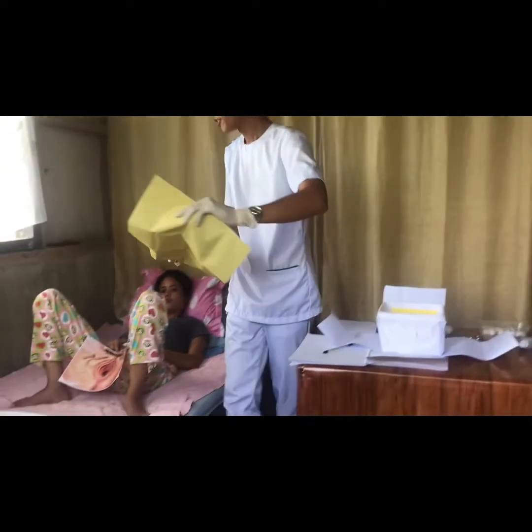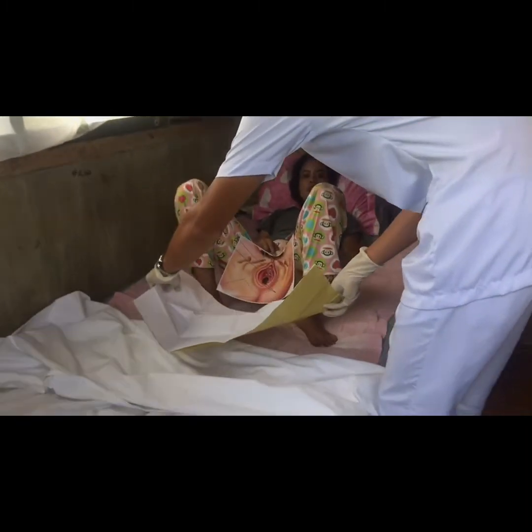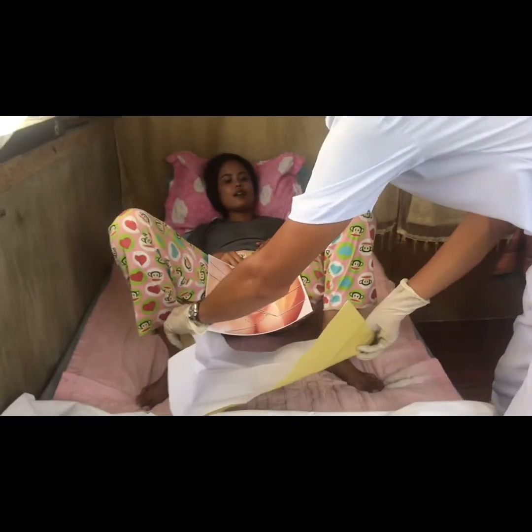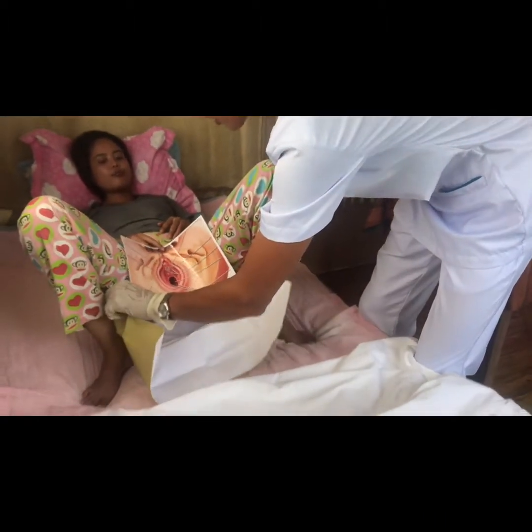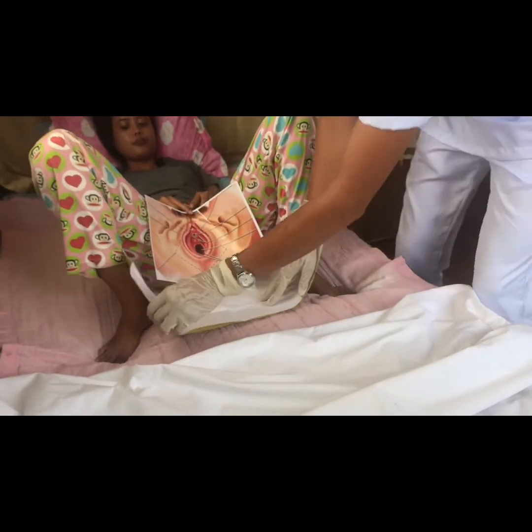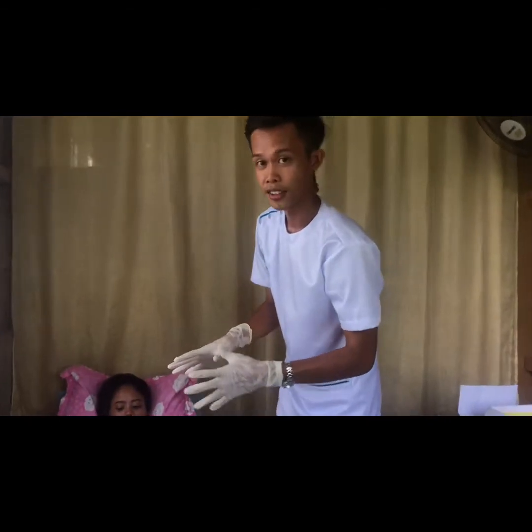So here, ma'am, please assist me. Please raise your waist. I'm going to insert it. Okay, ma'am, please rest. Okay, thank you. Okay, now, so as you can see, the drape is now inserted underneath the patient.